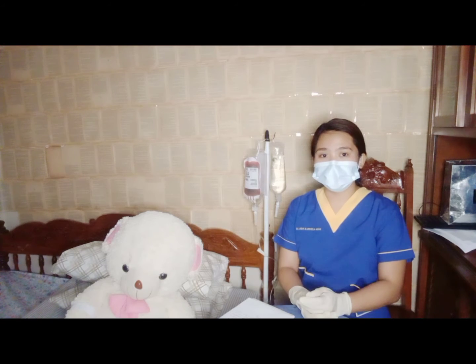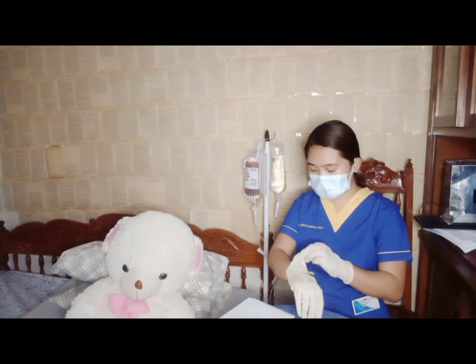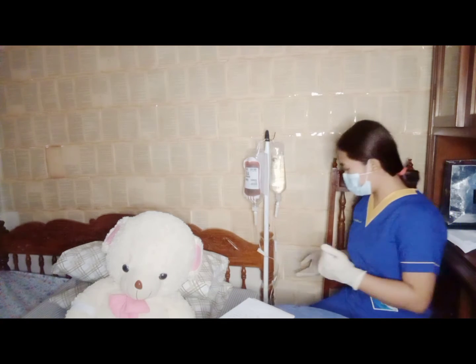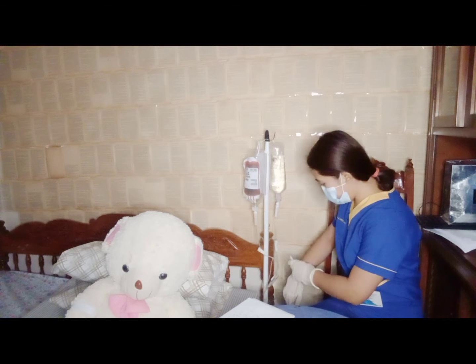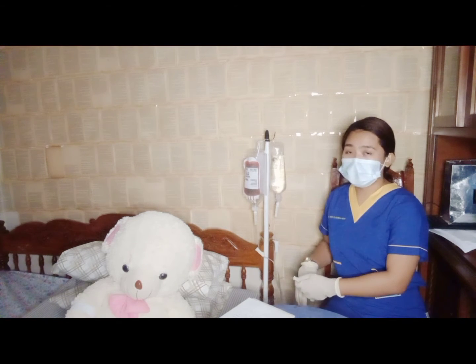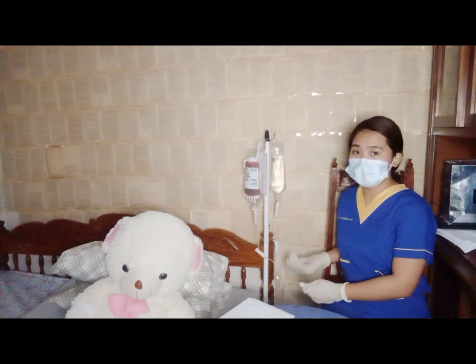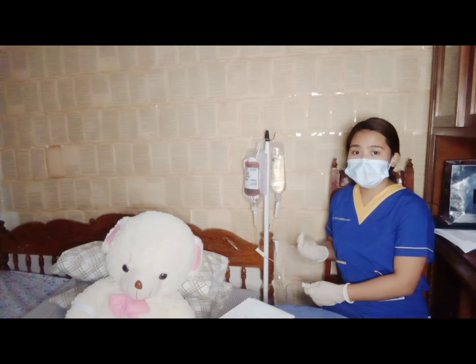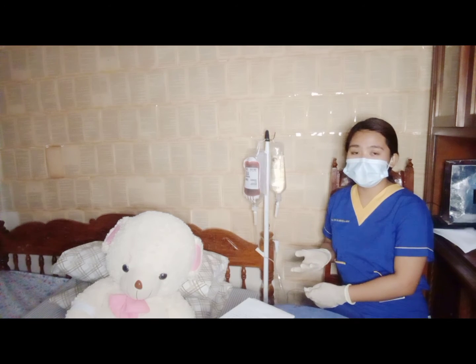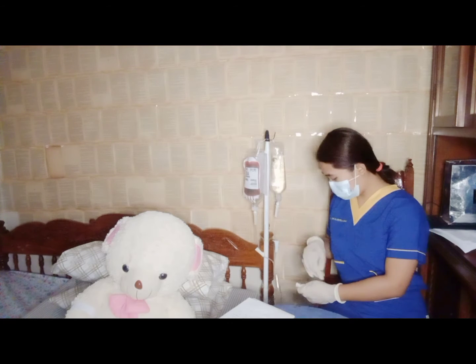Then, after 15 minutes, we will increase the flow rate of the blood. We need to increase the flow rate, of course, para matapos kaagad yung ating blood transfusion na kailangan matapos siya within 4 hours or no more than 4 hours. So, ito yung kanyang required na time frame.